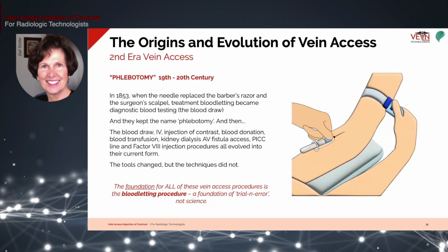But at that point in time, when it went to a needle and the risk of bleeding to death was no longer a risk, that tourniquet should have been put away, but it wasn't, because it got harder to find that vein that you're going to stick with that microscopic needle. And again, somebody went, you know, if you put a tourniquet on, it'll enlarge that thing and it might make it easier to find it. But we all know that that doesn't work real well.